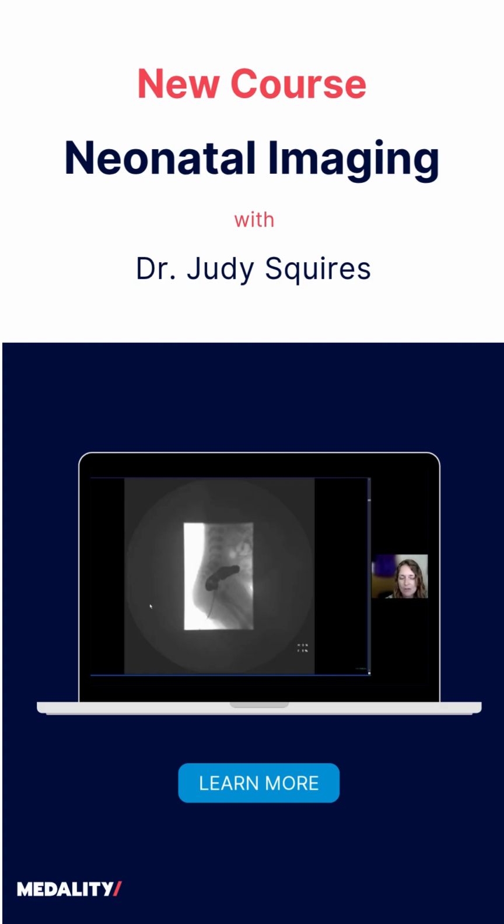So after our scout radiograph, a tube is placed in the rectum of the infant and water-soluble contrast is slowly administered. This is the left lateral decubitus lateral view of the rectum. And in the setting of suspected distal bowel gas obstruction pattern, this is one of the more important images to get. So we inject contrast and we slowly watch the contrast column as it moves in a retrograde manner.